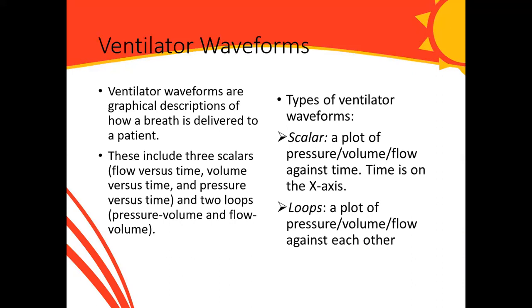All right, so ventilator waveforms is not part of your lecture, but I felt I should just mention it to you. Ventilator waveforms are very important because they can be very diagnostic. They can help with diagnosis. Ventilator waveforms are graphical descriptions of how a breath is being delivered to the patient by the ventilator.